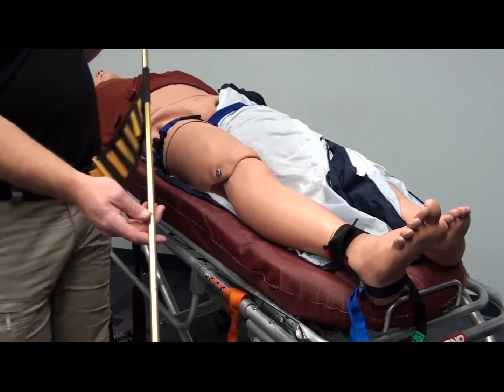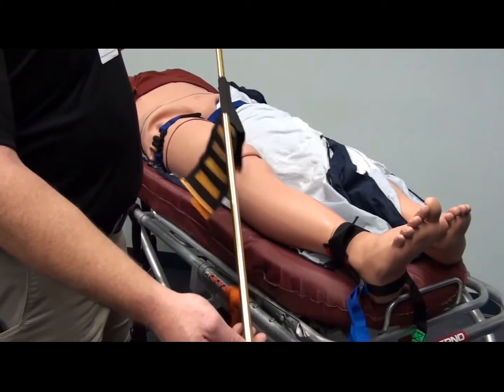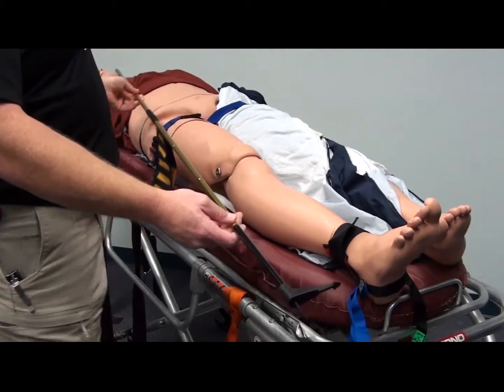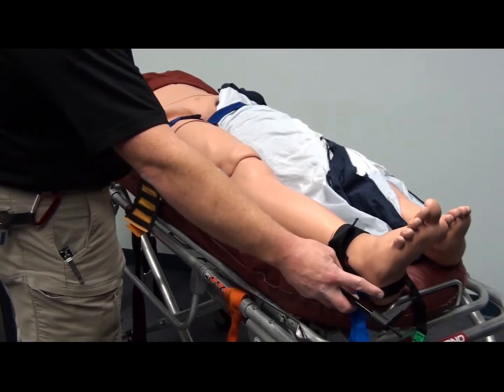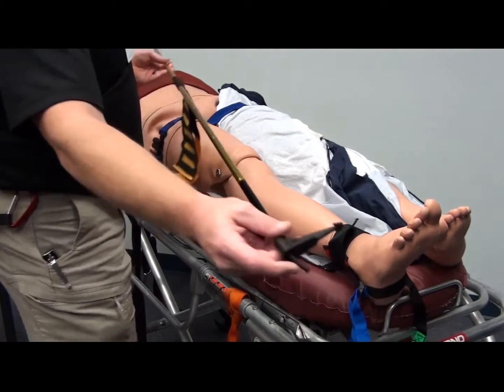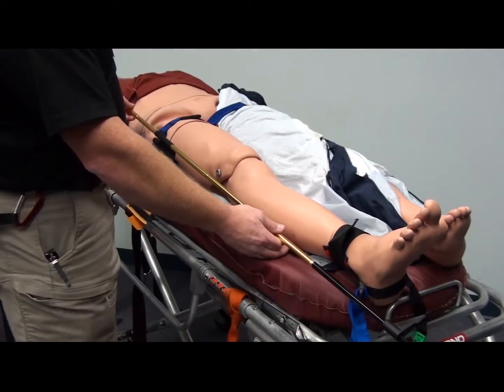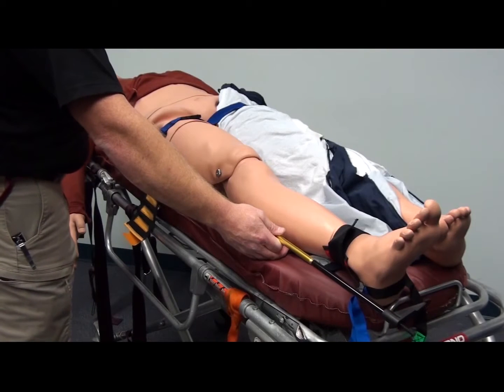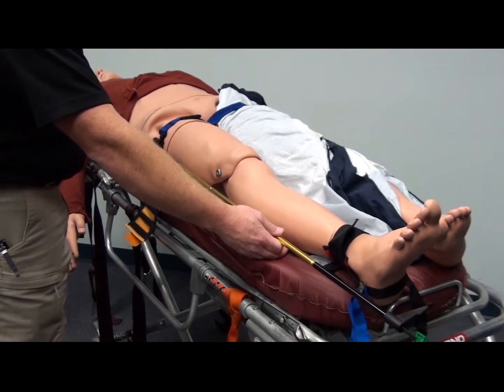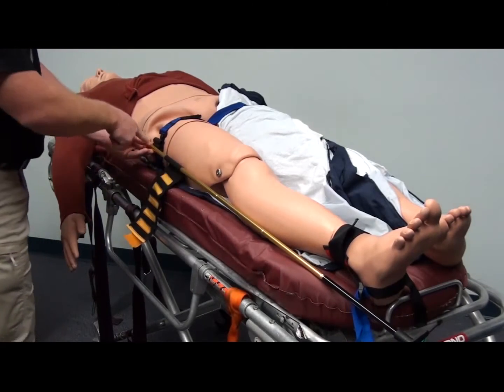secured. Now we are going to take our traction pole, and we are going to measure on the person's leg. So I would say 2-3 inches below the bottom of their ankle is where you would want this part of the traction pole. And now just simply gauge as to where the break in the pole is up near the Ischial strap here.